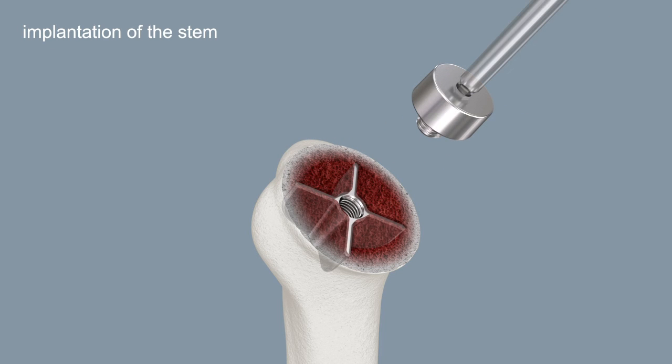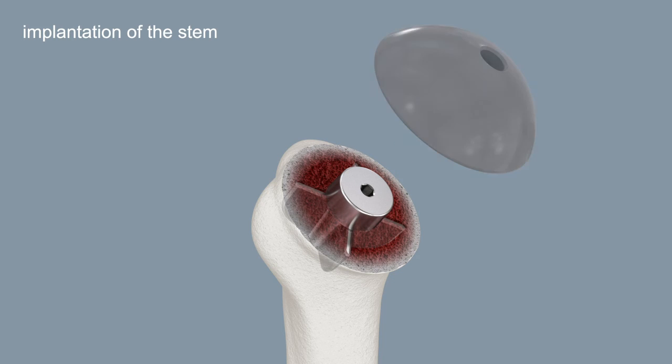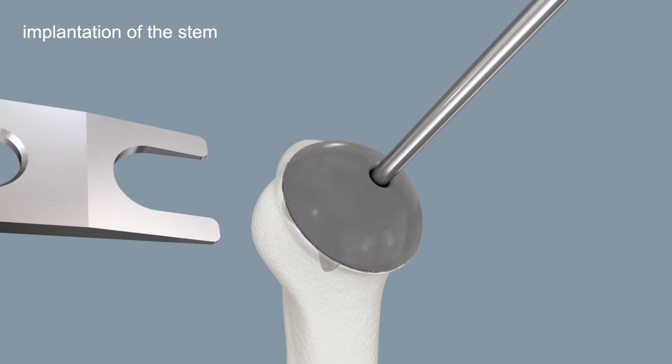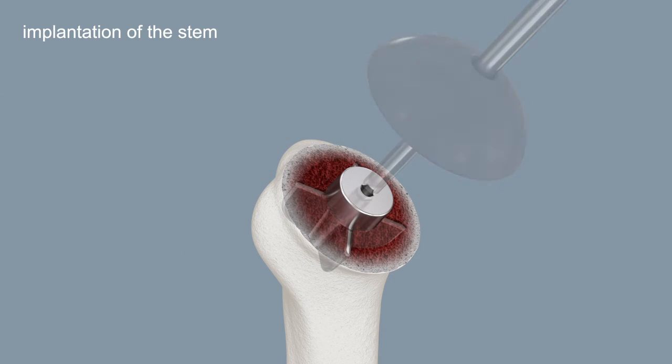The trial cone is screwed into the stem impactor with the screwdriver. Place the appropriate trial head on the trial cone. Remove the trial head with the head extractor and the screwdriver. Remove the trial cone with the screwdriver.